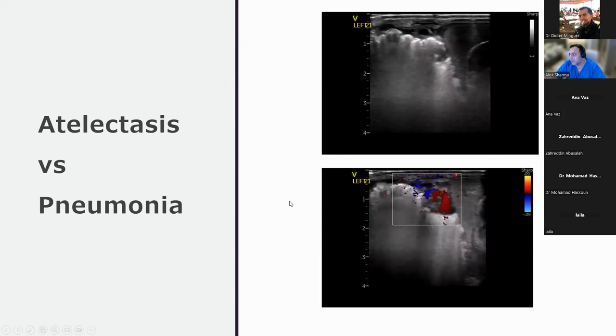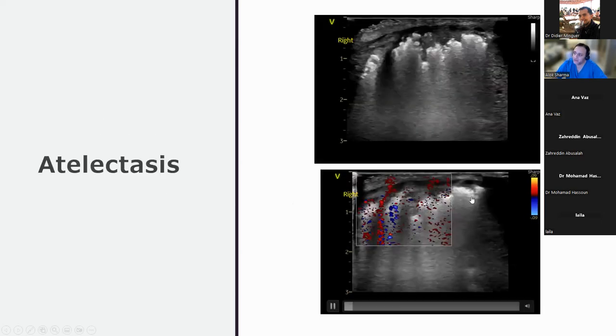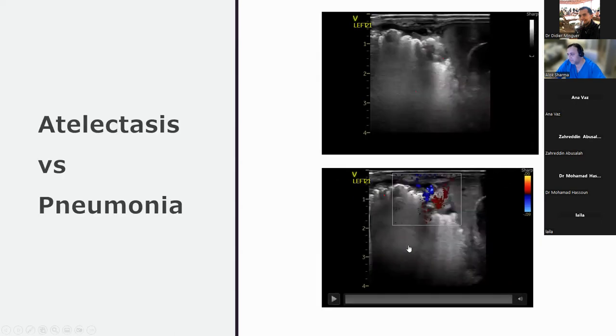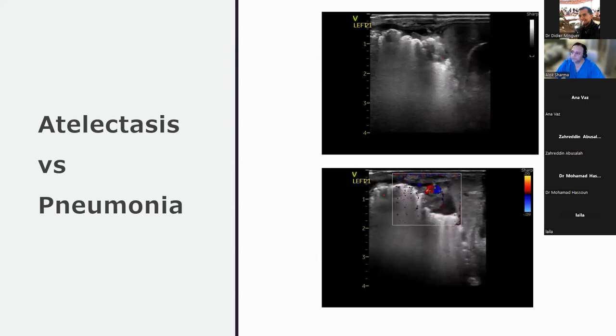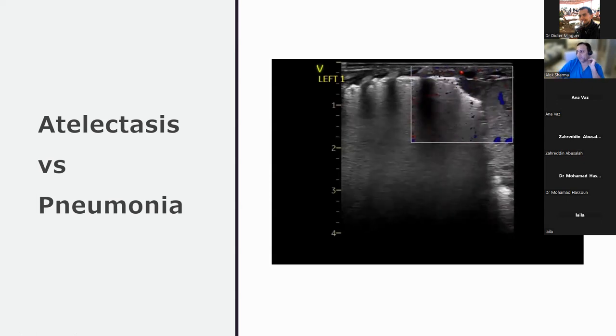So can you see how the blood vessel arrangement is within that area? It's very focal, as opposed to being just diffuse and speckled. So if I just show you this, you've got a speckle kind of appearance, but here it's much more focused. What about here? What do we think, guys?